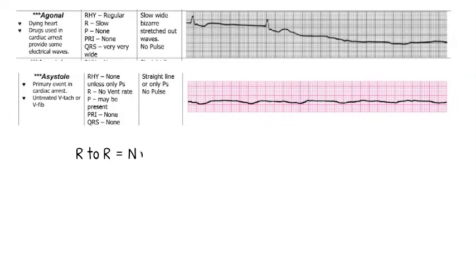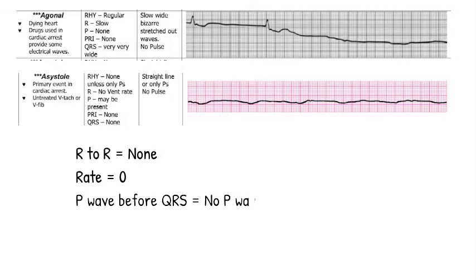A pacemaker rhythm is often characterized by a spike before the QRS. This will help you identify this rhythm.